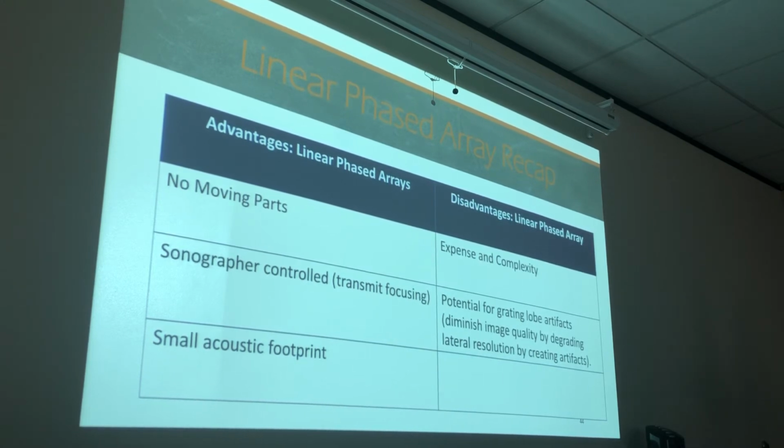Is that what they use for the vascular? We used it yesterday, right? It's the skinny one with the red on top, a little square? Yeah, that's it. Yesterday, really, for vascular? James? No, not James. My specialist was using it yesterday. She had a patient. The only thing I don't like about this transducer is a real grainy image. It's not a real pretty image. It's super grainy. It doesn't look great to me at all.